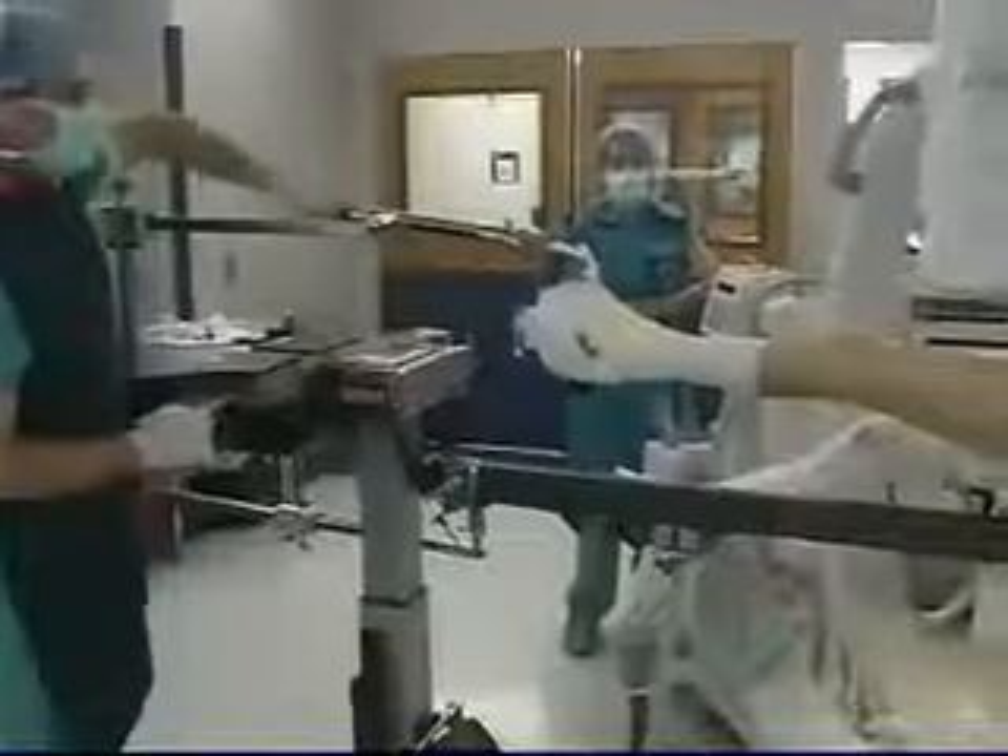The fracture does sag posteriorly. Pushing from down up on the proximal part and down on the distal part usually reduces the fracture.